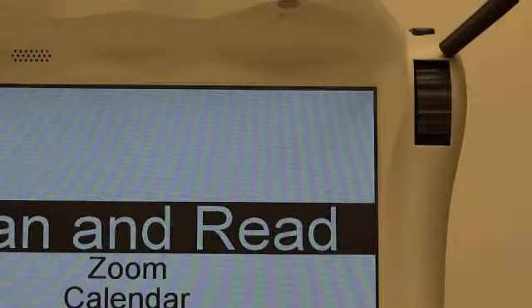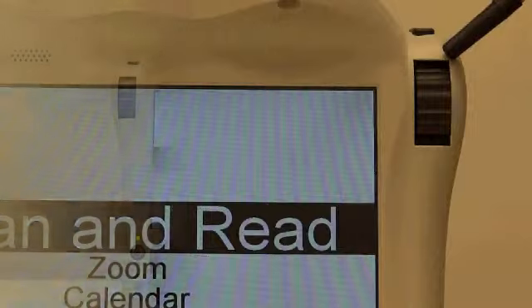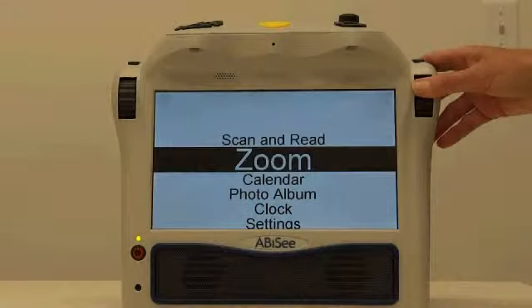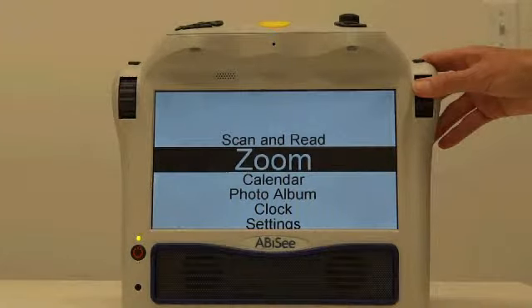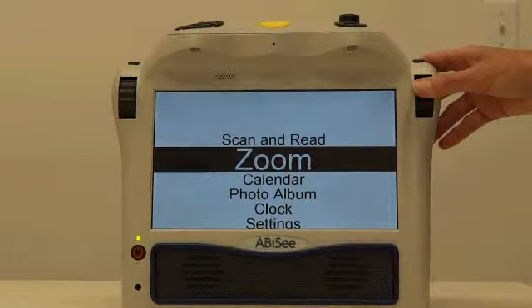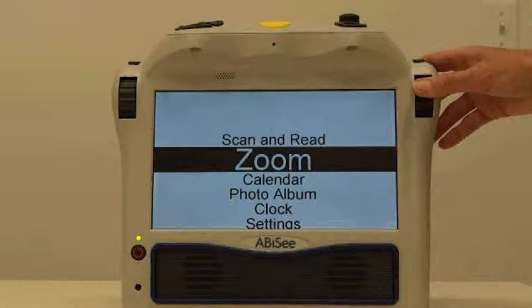Use the right roller to scroll down to the next menu option. Zoom. The Zoom option is used to magnify a small object like a hearing aid, or to write a check, fill out a form, or do any other task that requires seeing a magnified image on the screen. Please note, only the right camera functions in this mode.